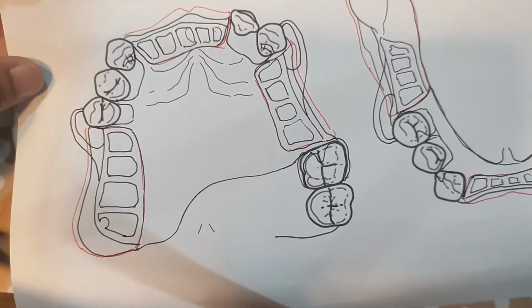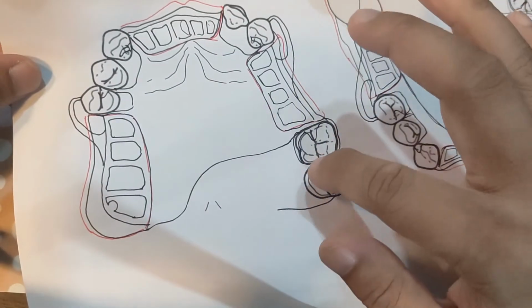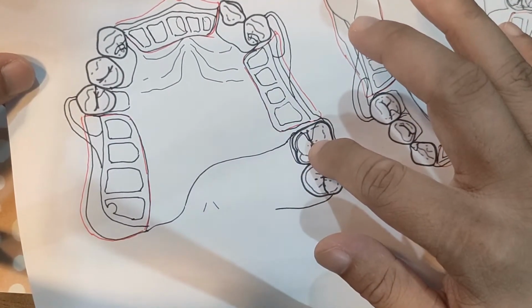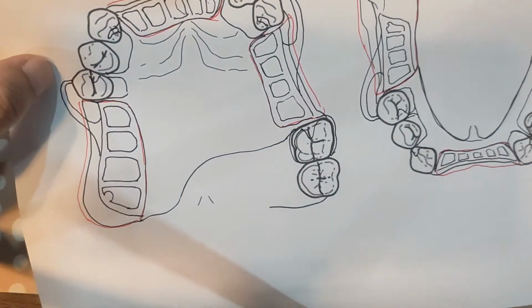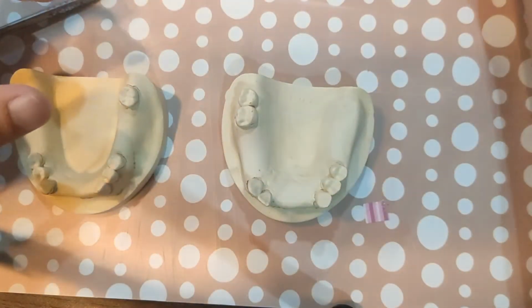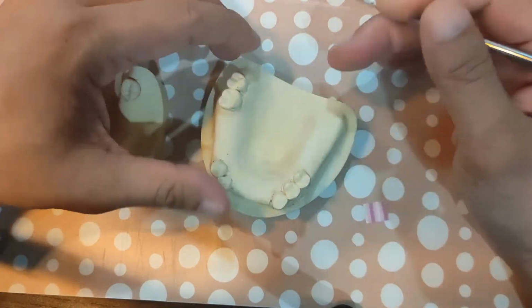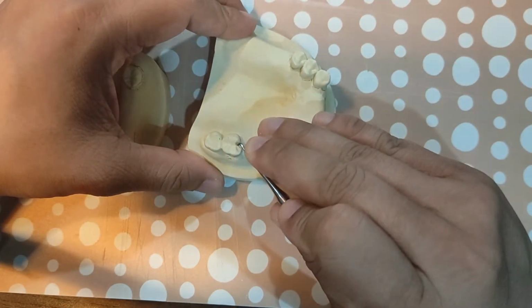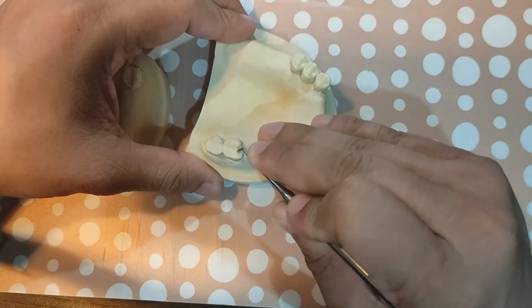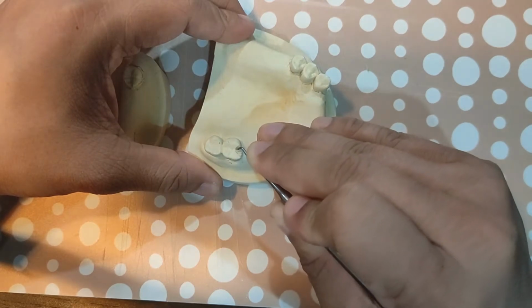This is my design. And let's see. We have cingulum rests on the upper canines, a mesial-occlusal rest on the 7, and a mesial-occlusal rest on the 5. Okay? On the 1-5. So, gagayahin nyo lang yung design. You take your carver, the cleoid end, and you make your rest seats. So, follow yung recommended dimensions. The deepest part of your rest seat should be where it's closest to the long axis of the tooth.